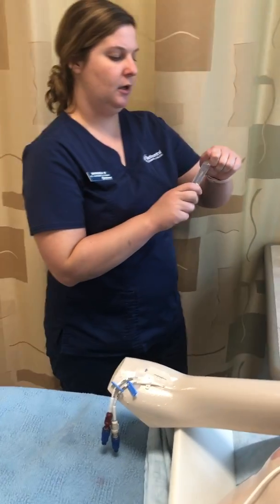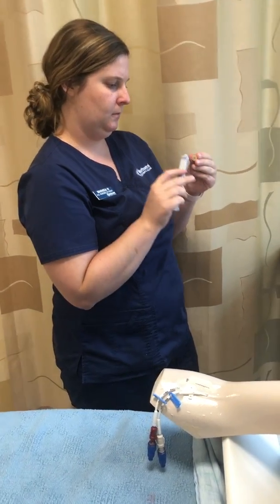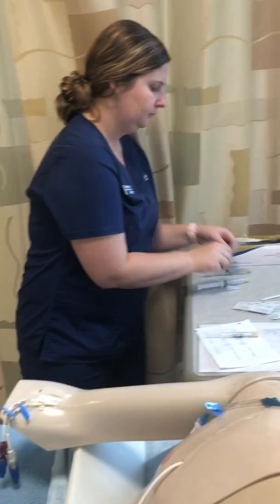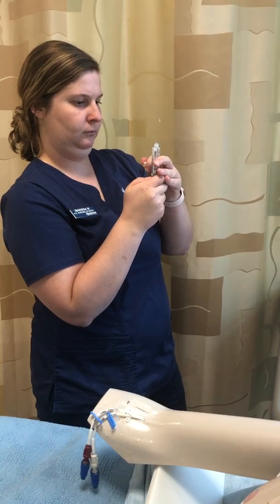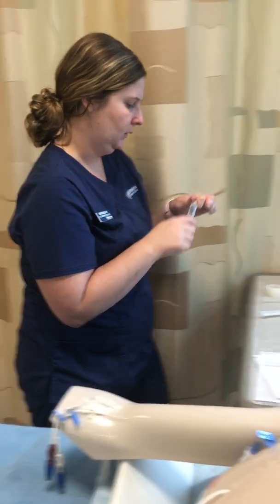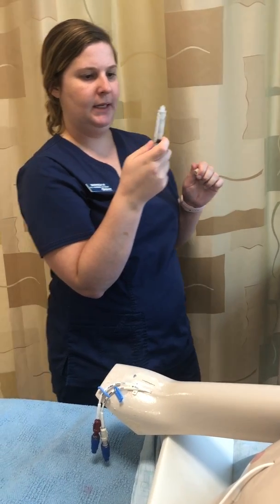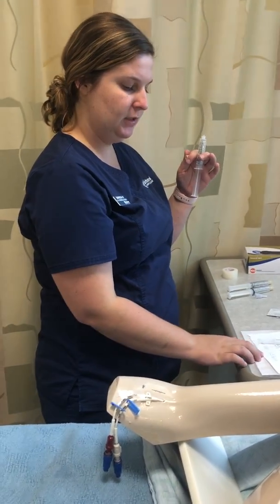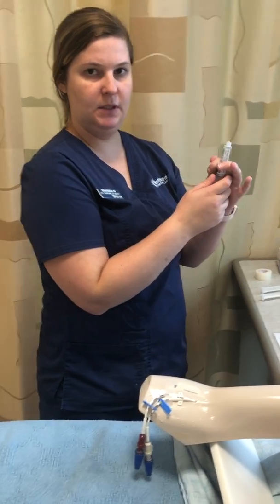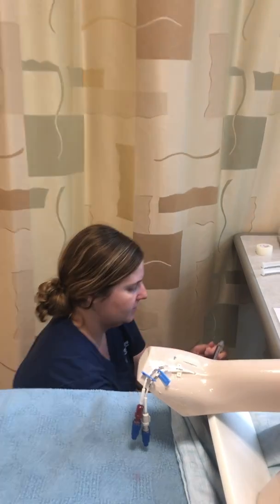So I'm going to get all the air out of my saline flushes. Alright, and my last one. And for my last one here, going back to my dilution that I figured out, I need to give this in 1.5 milliliters of saline, so I'm going to go ahead and make this 1.5 milliliters of saline.